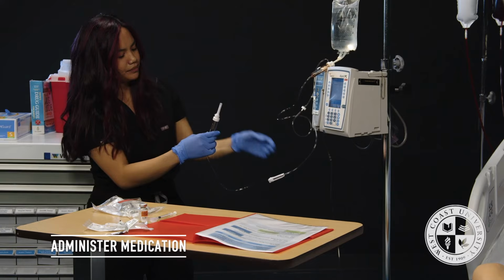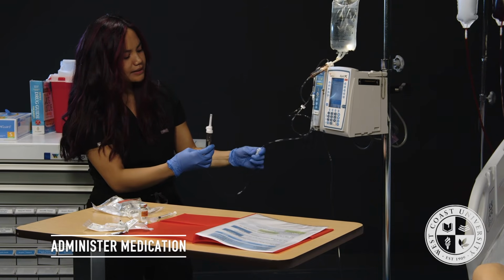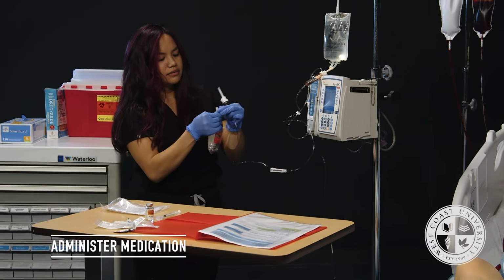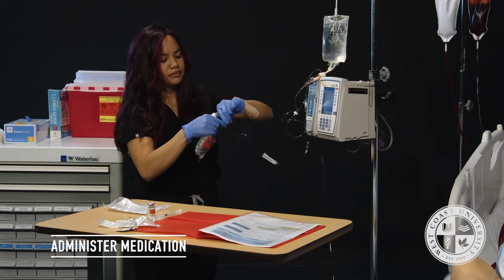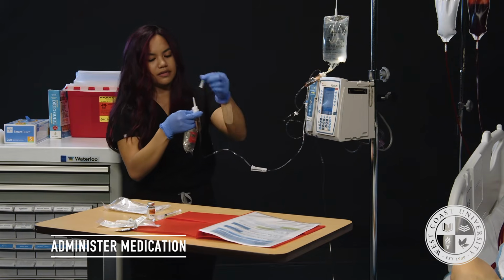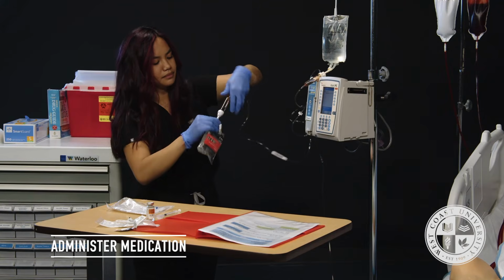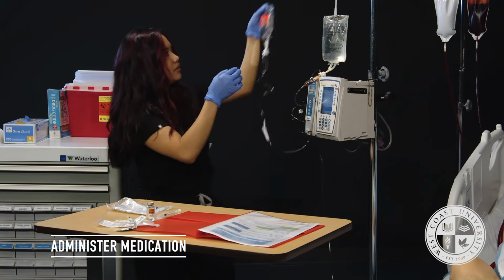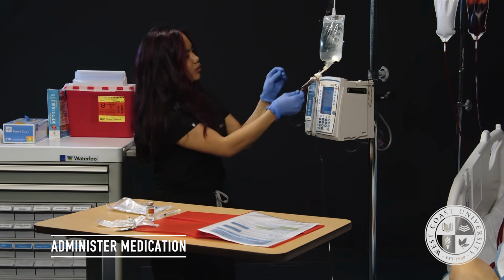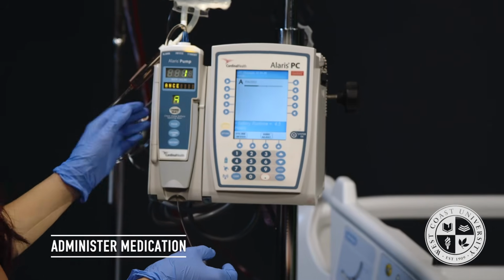Let's see over here. I see that my chamber is filled up halfway. I'm going to go ahead and clamp my secondary tubing and grab my Heparin medication. Go ahead and remove all the covers. I'm going to poke my secondary tubing. Go ahead and hang it up. And while my pump is still paused, I'm going to go ahead and program my Heparin at 15 minutes.